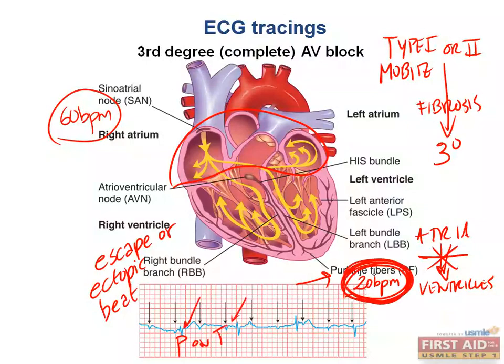The P on T wave phenomenon should make a lot of sense because your Purkinje cells are setting the baseline depolarization rate in the ventricles, while your SA node is setting the baseline depolarization in your atria. So you can have a superimposition of the P wave on top of a T wave. You can also have a P wave on an ST-T complex. An ST-T complex is just another way of talking about repolarization because it can sometimes be difficult to determine where the ST segment ends and the T wave starts on the ECG.